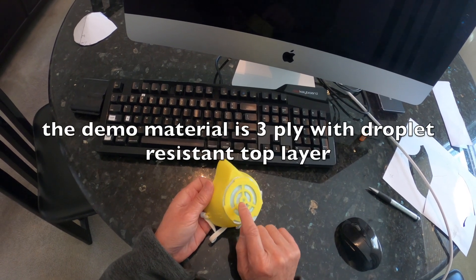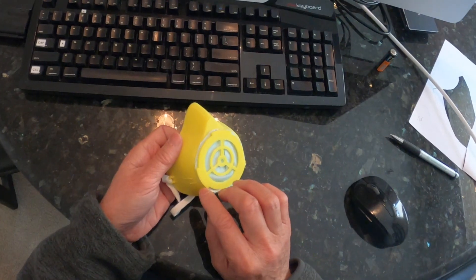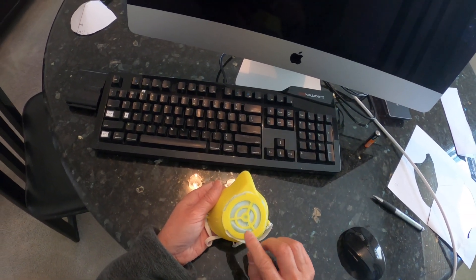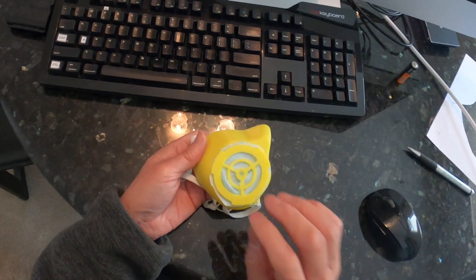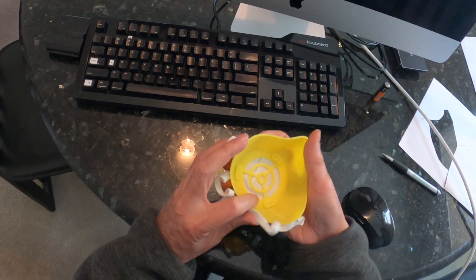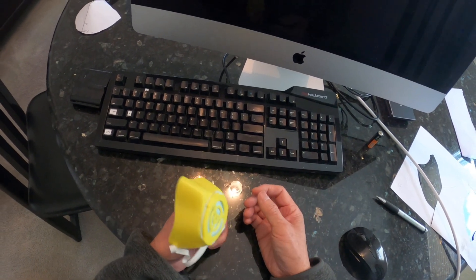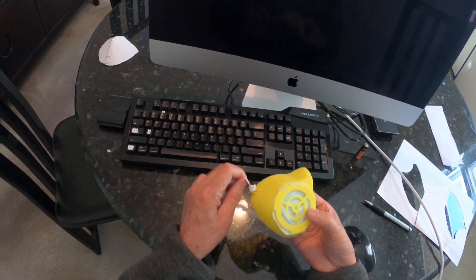You can use any kind of material. This filter material has three plies: a plastic-coated top, a synthetic material as the second ply, and a third layer. The top coating is supposed to stop droplets from going through — that's the idea. That's the inside. I'll give you the link to the Thingiverse file if you want to print one out.